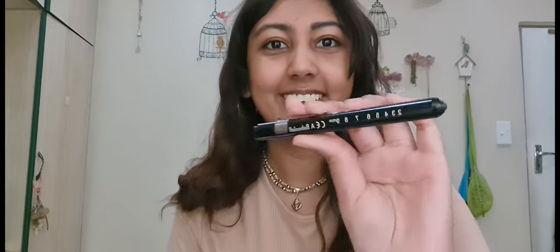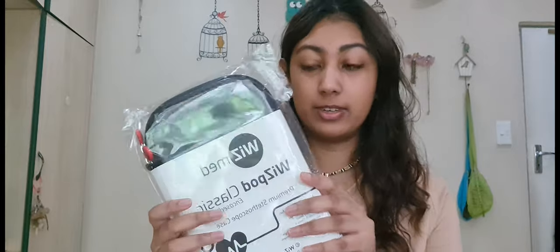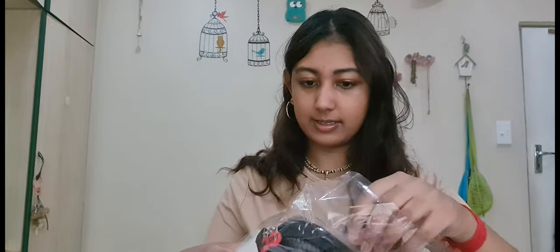I also need a pen torch. It says it needs two AAA batteries, and I did get my name included on it. This is the student one. So this is my pen torch. I also got the stethoscope cover, and this is the casing for the stethoscope.